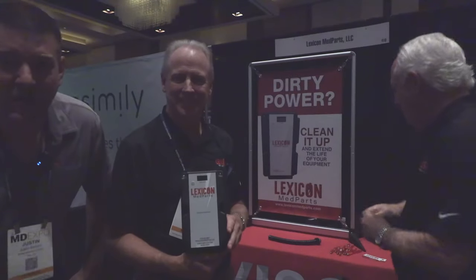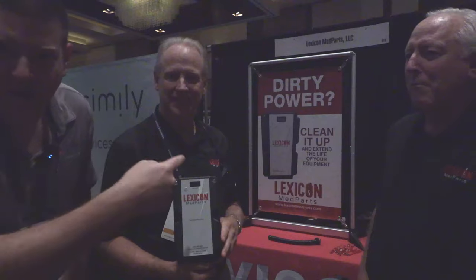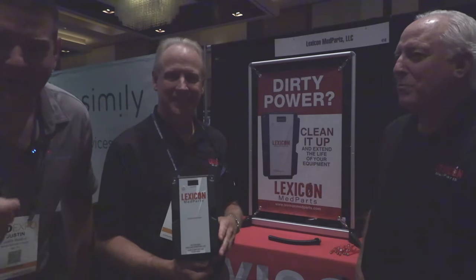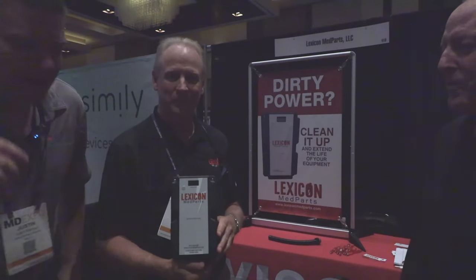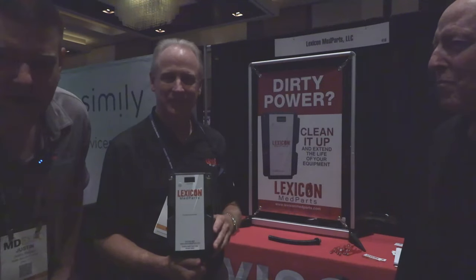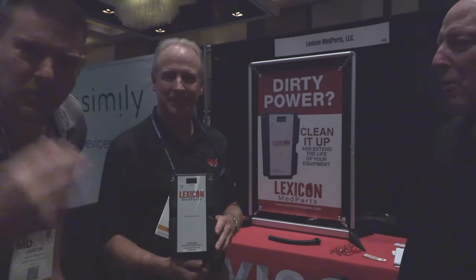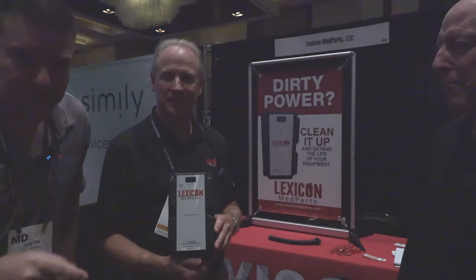Hey everyone, welcome back to Better Biomed. I was walking by yesterday and I seen this backdrop that says 'dirty power,' and I knew I had to come back and take a look at it because this is a product I haven't seen before. I have a lot of questions when something of this small form factor says it can help clean up dirty power — which any of you guys that have had to deal with artifacts and random blue screens of death on your x-ray equipment know.